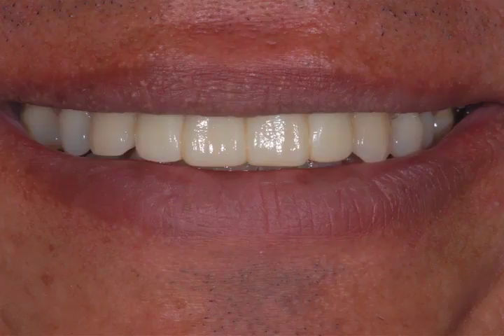It was one of the most perfect fits we had for an anterior bridge. You can see the aesthetics are well satisfied — the mesial-distal width proportion looks good, the smile line meets the incisal edge, the incisal edge proportion looks optimized, and it looks like a very nice restoration. Here is our patient's final smile, and you can see he is certainly very happy with the result.